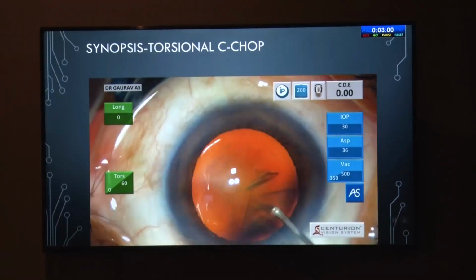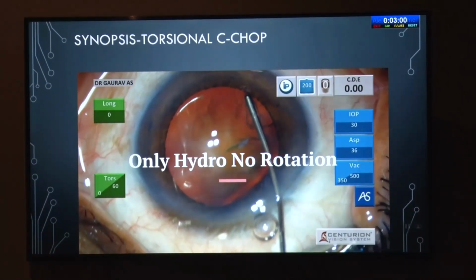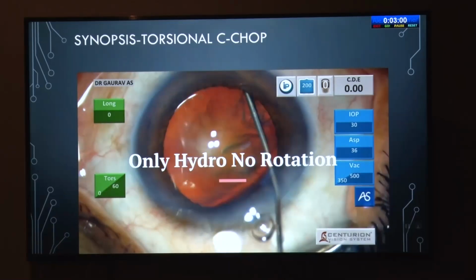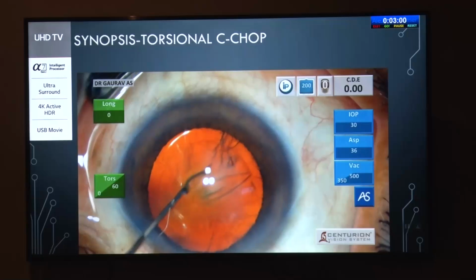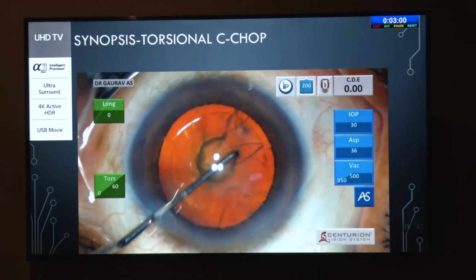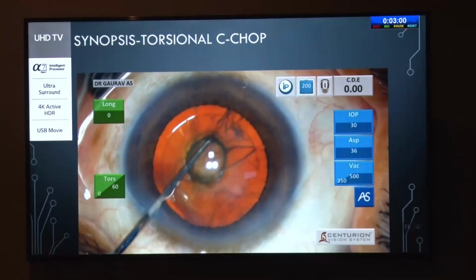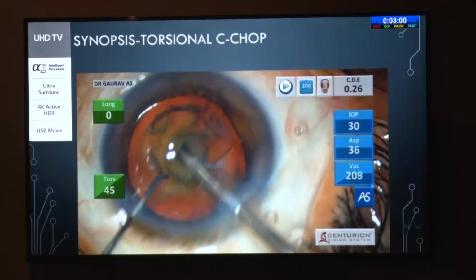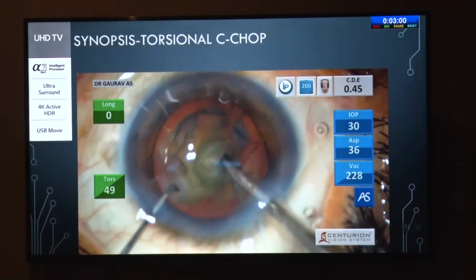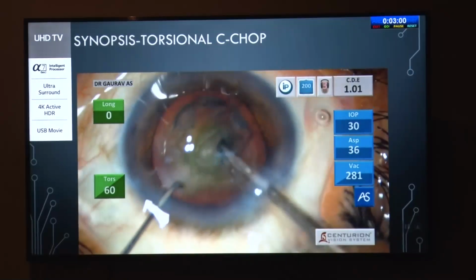I make a regular capsulorhexis of 5.5 to 6 millimeter. I do not do rotation of the nucleus, I just do my hydrodissection. Then I mark the central area with the Sinskey hook, which is approximately 2 to 3 millimeter. After marking the central nucleus, I use the torsional phaco just to make a crater according to my depth.